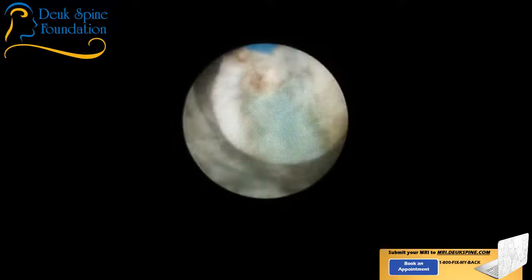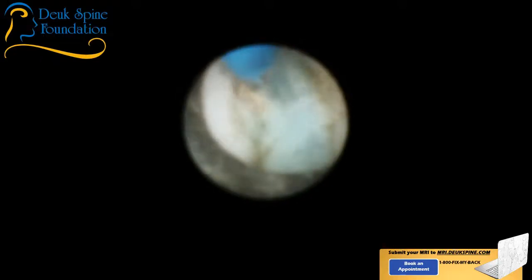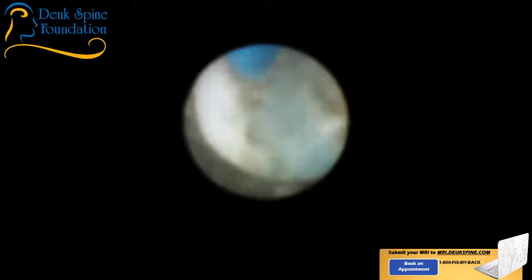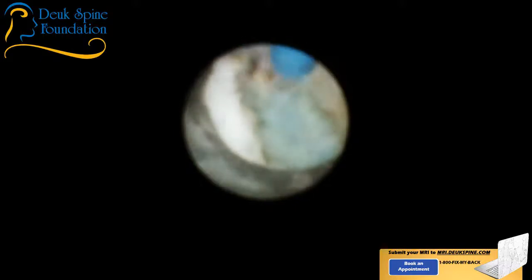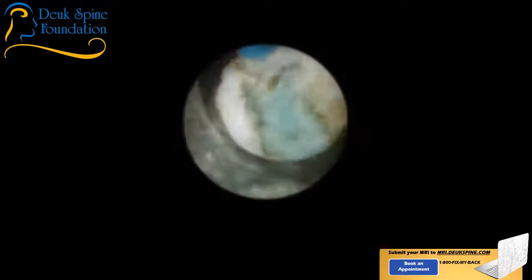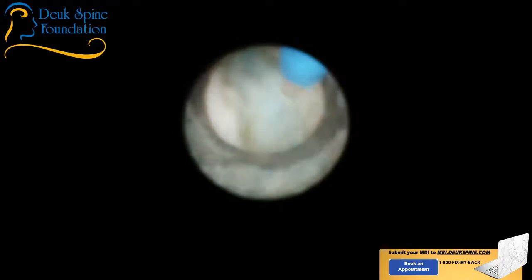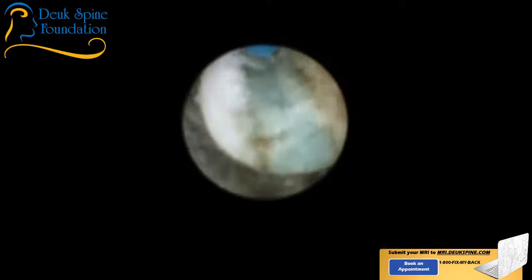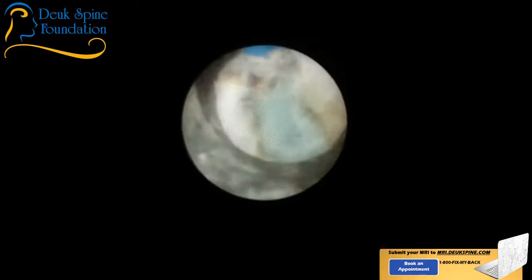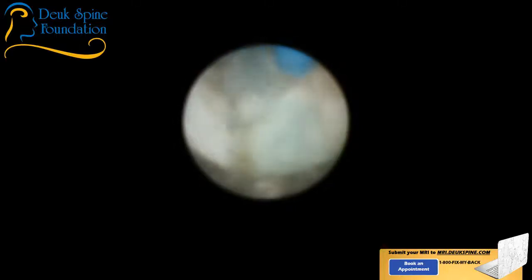You have to be careful because there's other things out here in the foramen, right? Besides the herniated disc, there's the things that are normally found in the foramen, like a nerve root. And you can even have the vertebral artery out here in the foramen. So I'm kind of poking around a little, gently, seeing if I can get any more herniation to move, short of using the laser to move it. So this foramen's looking pretty darn good to me. It's looking good, okay? There's no more herniations. Remember what it was like when we started. Go rewind, you'll see.